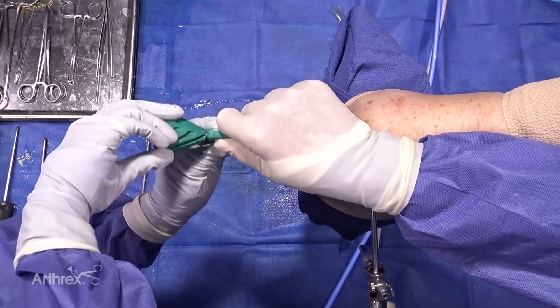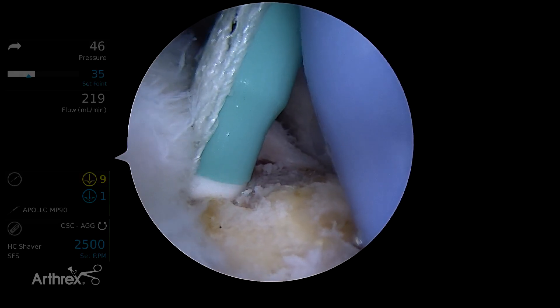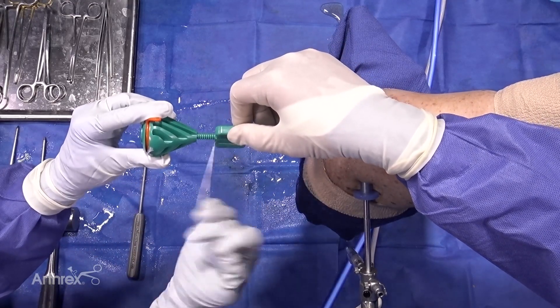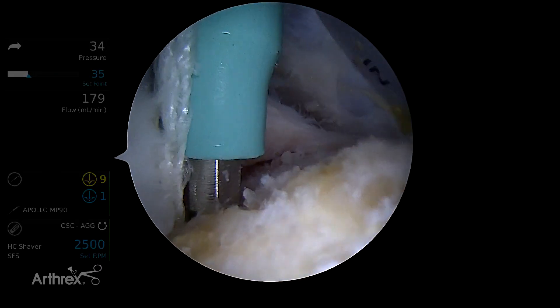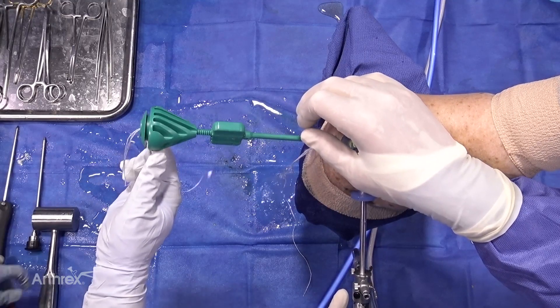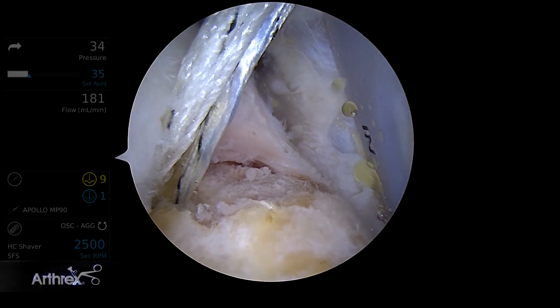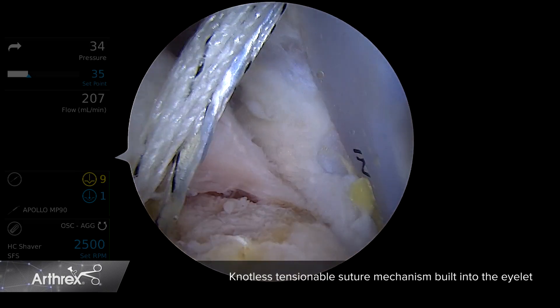Now we're trying to place our swivel lock in. This is a knotless swivel lock. I'm going to back off that sleeve just to be sure that I'm at or slightly below the surface with my anchor — and that looks just about perfect. So we'll take off the tab from the handle and then we'll just remove the inserter. And there's our anteromedial knotless swivel lock anchor.